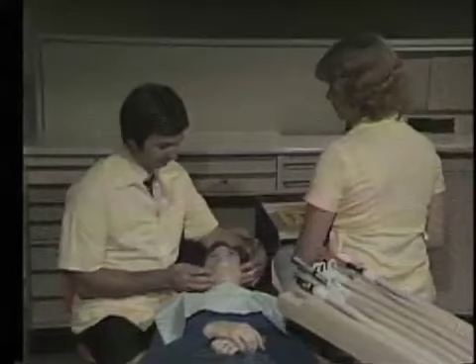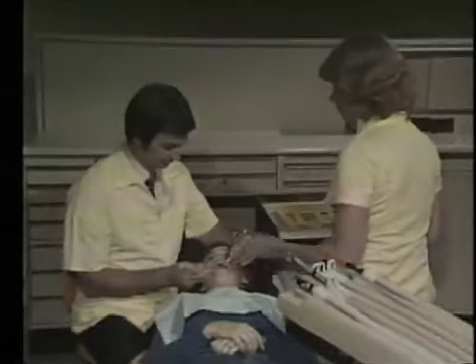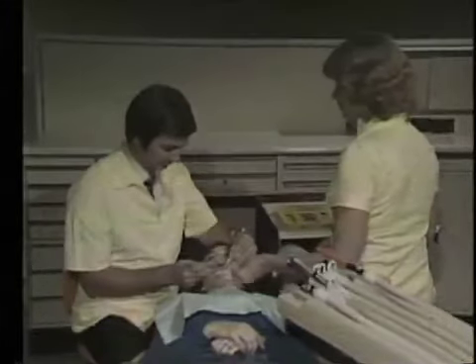It is important to always position the patient from the head down. The head should always be as close as possible to the upper end of the chair. The chair is narrow and thin in this area, and optimum access can be achieved.